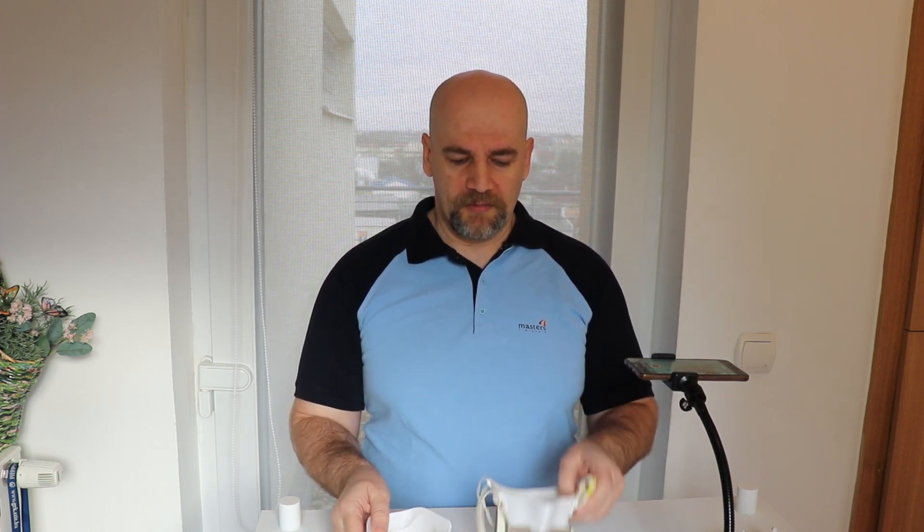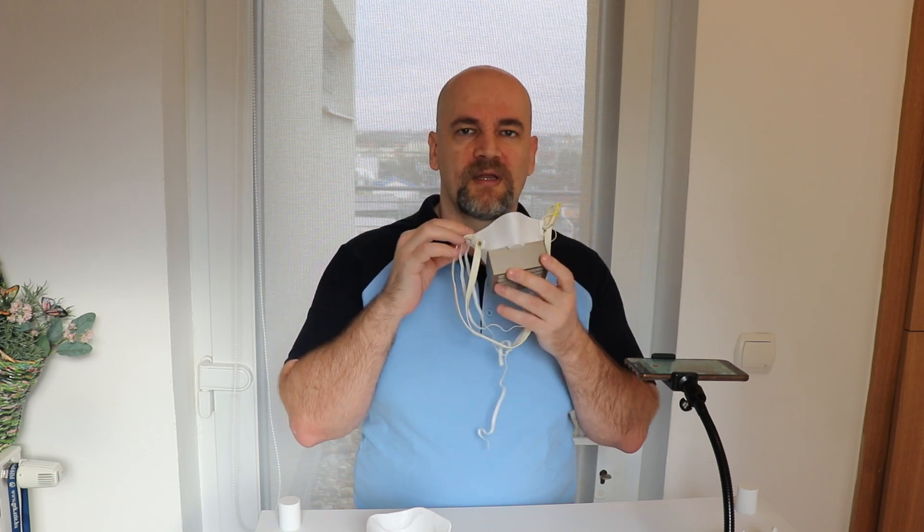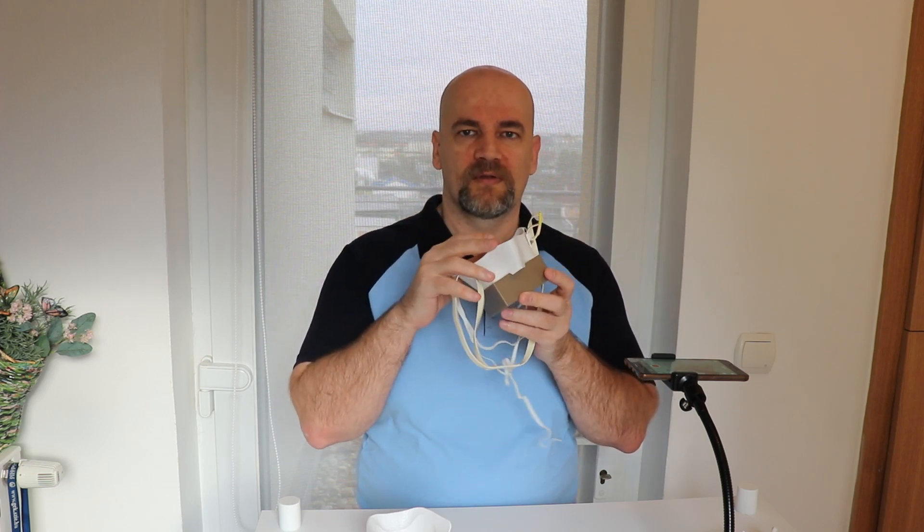Okay, let's go step by step. So what is the purpose of this plastic? The purpose is that when you put it on a face, it has to fit your face perfectly to get the best sealing around the edges of the mask.